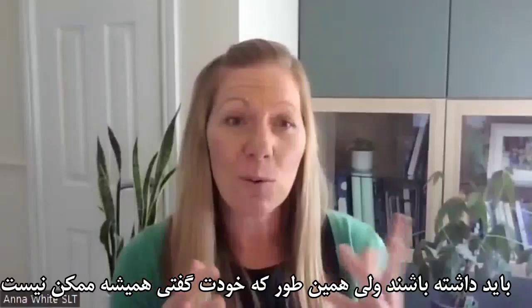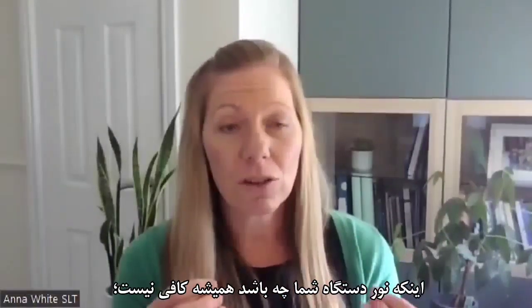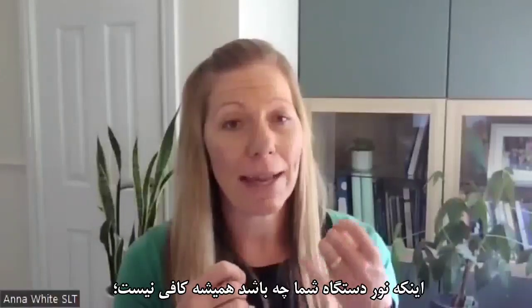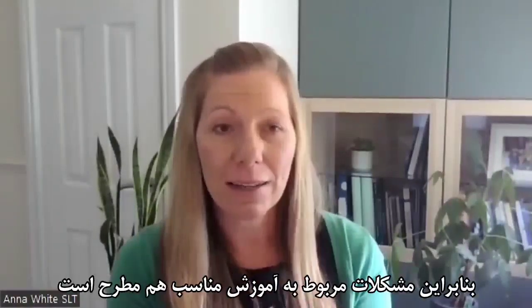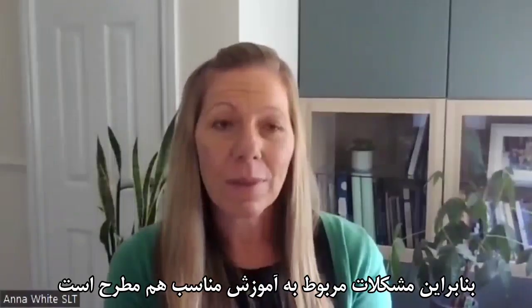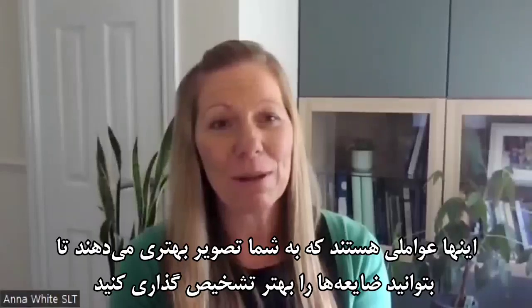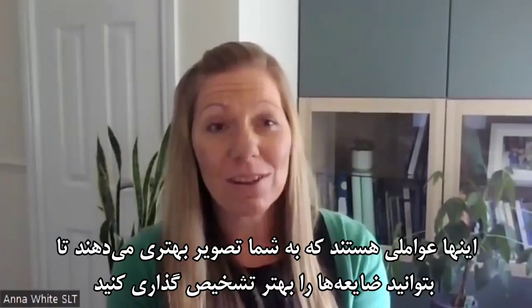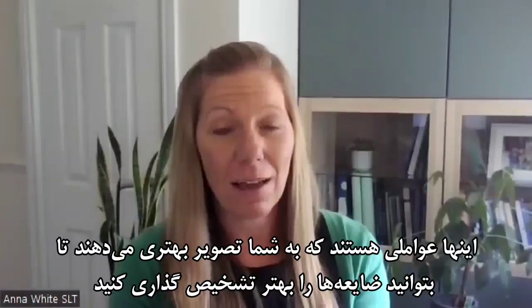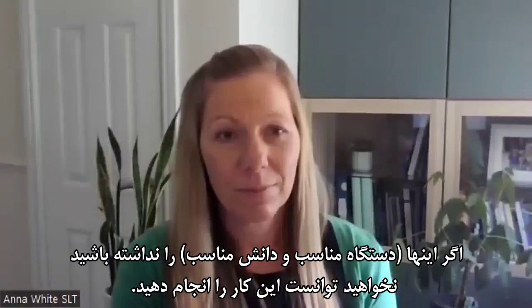They should, but as you've said, it's not always possible. Funding isn't always there. It's not just good enough to have the light. You need to know how to interpret what you're seeing, so there are issues around training as well. But the facts are that it will give you a much clearer picture, and you'll be able to diagnose lesions that you wouldn't be able to if you didn't have it. Exactly.